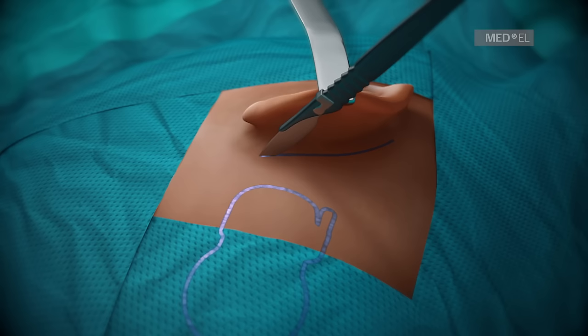A small incision of 3 cm can be performed for all pin implants.